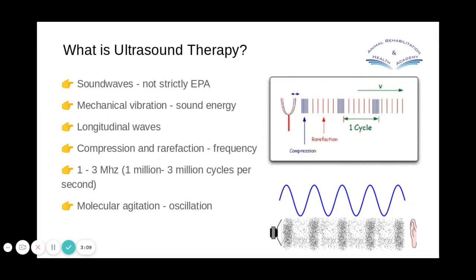A lot of the electrophysical agents do the same or a very similar thing to the tissues. It really comes down to how deep they go and what tissues they interact better with or get absorbed into. That's where your selection of what modality you would use comes in. But the physiological effect within the tissues is quite similar between the different modalities.